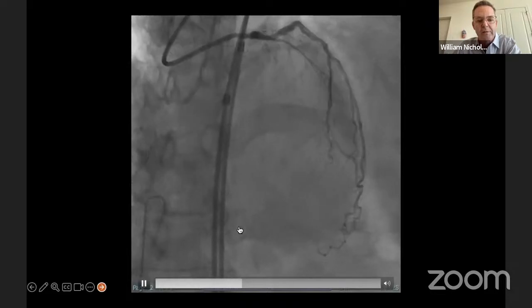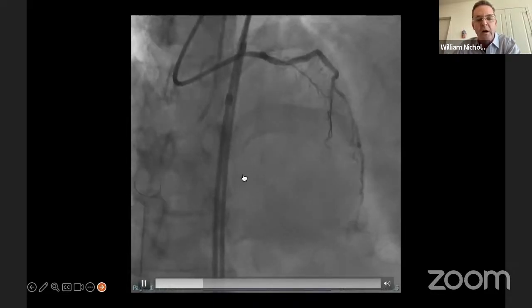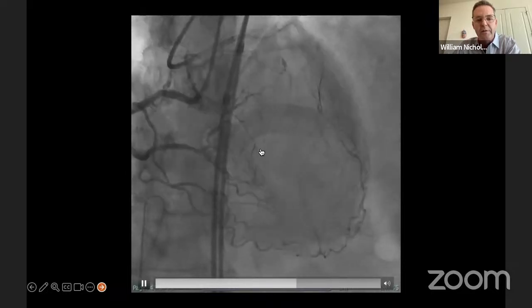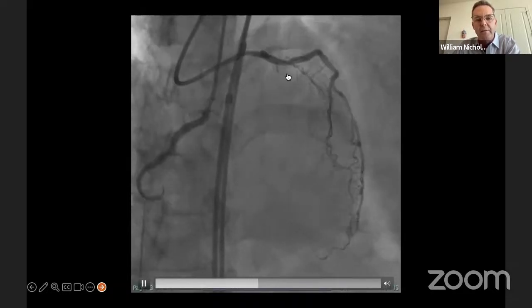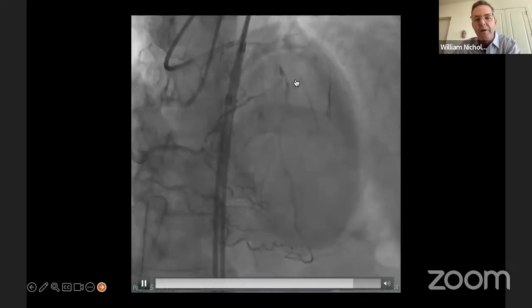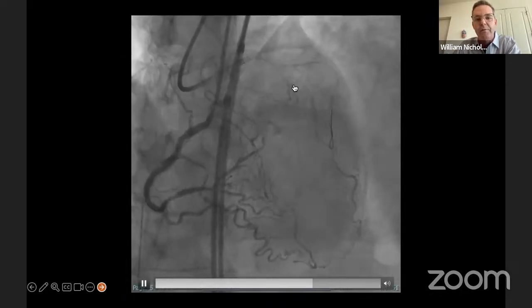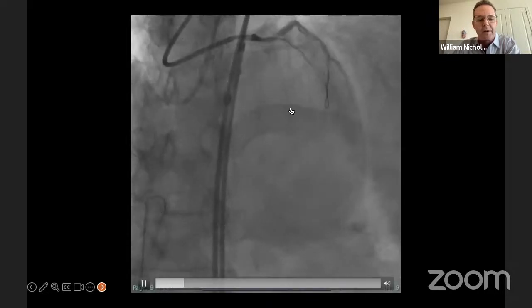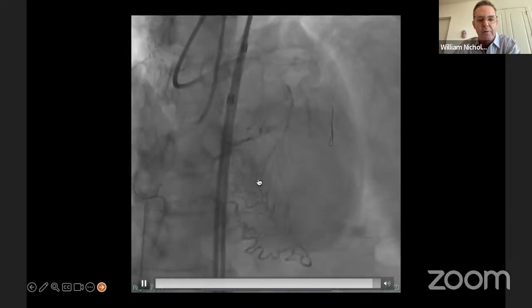We did not feel that this epicardial was usable. We did surf these septals quite a bit, thinking that a retrograde strategy would be nice to start out with and at least define the anatomy. I think a tip injection, if you were able to get retrograde, may define whether this is truly another CTO, or whether there's a confluence of this LAD diagonal bifurcation. We were not able to get through the septals despite trying for quite a bit of time.